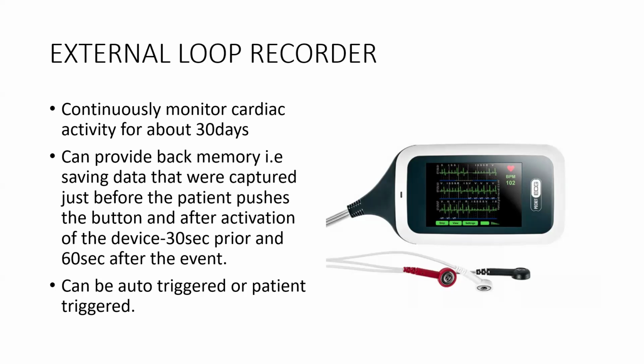So it can be set such that it can be automatically triggered, for patients with syncope. Another advantage is that it has the ability to store previous data, such that recent events' memories are stored.